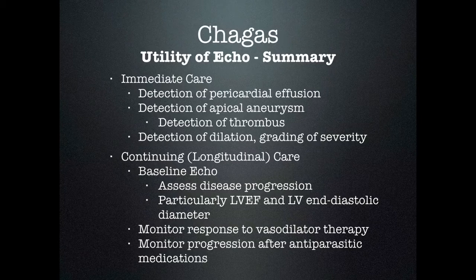If we're going to be in a place for a longer period of time and we can provide longitudinal care, we can use ultrasound to establish a baseline echo. Then we can assess for disease progression. This is particularly useful in looking at the LVEF and the LV end diastolic diameter. If these are worsening, then the disease is continuing to progress. We can also use this to monitor response to vasodilatory therapy, as well as monitor progression of the Chagas cardiomyopathy after we've treated with antiparasitic medications.